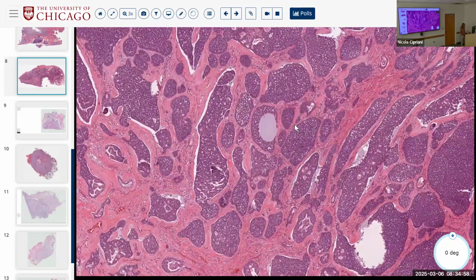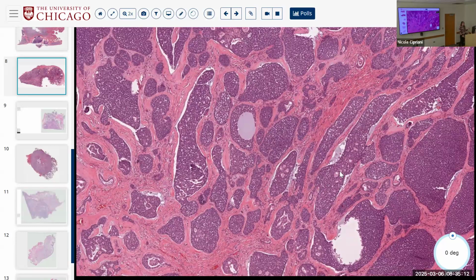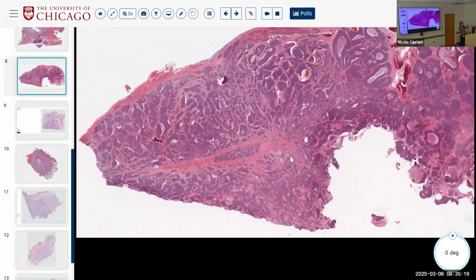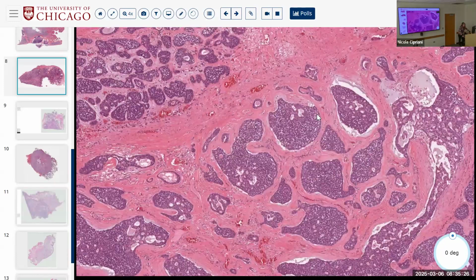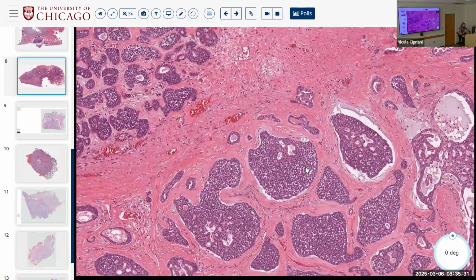Awesome, awesome. Thank you, Emily. The key point that she brought up is that this is high grade. So you've got your most important clinical indicator, that this is a high grade carcinoma. It's very solid. Even though the border is kind of lobulated, there's kind of stromal desmoplastic infiltration. There's that central necrosis that we saw. There's a lot of apoptotic and mitotic debris, prominent nucleoli. So you're dealing with a high-grade carcinoma.